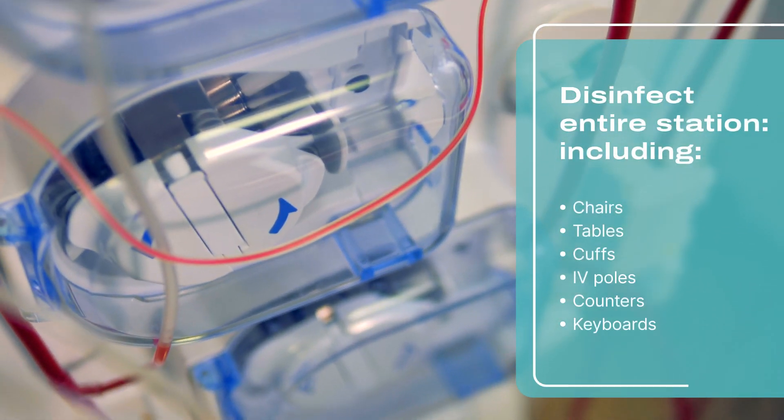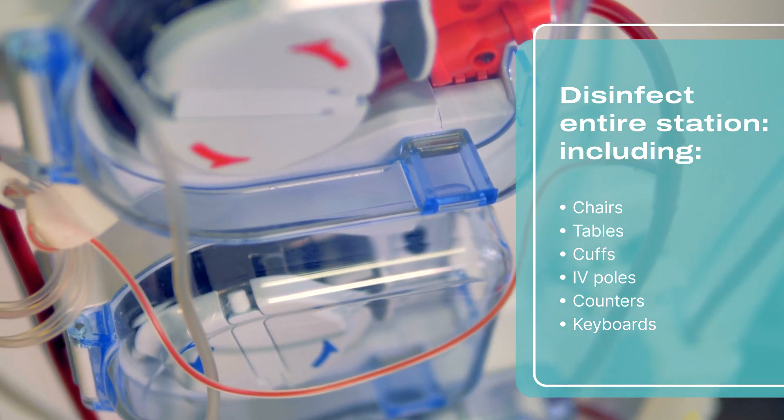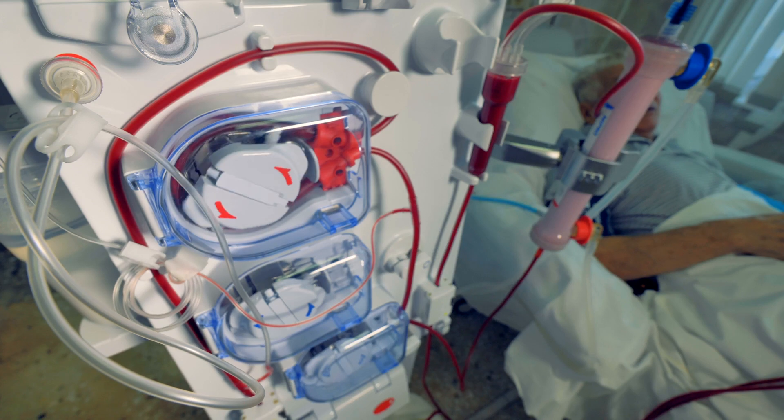The entire station, including chairs, tables, cuffs, IV poles, counters, and keyboards must be disinfected. Always be sure to check and follow manufacturer's instructions for your machine.